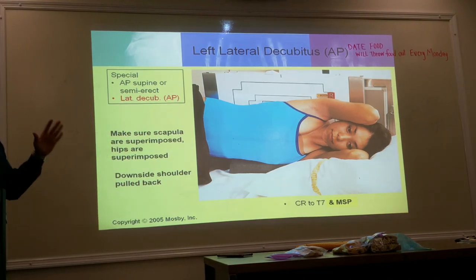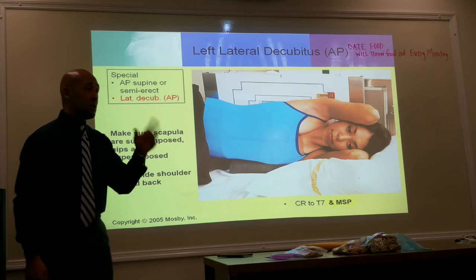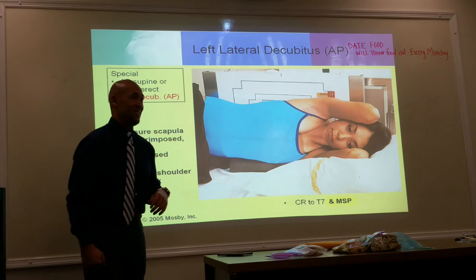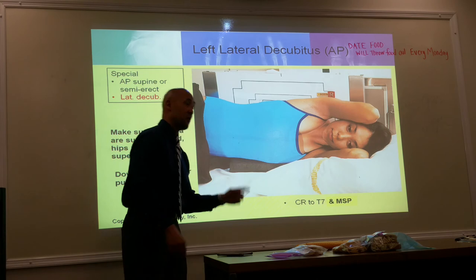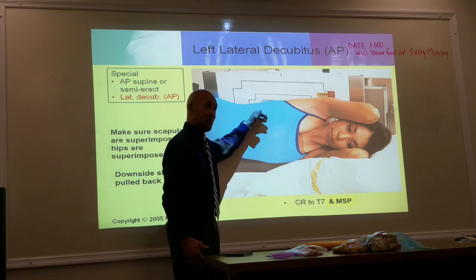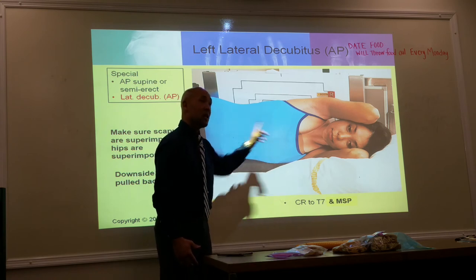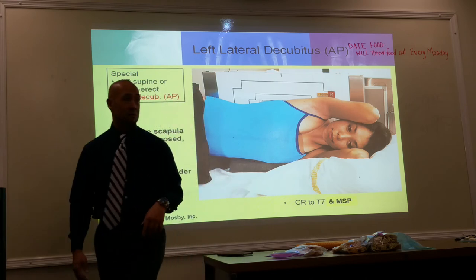But it's got to be bilateral lung, so we're going to get the picture of the whole. Right, but again, get your patient history first, because are we looking for fluid levels or are we looking for pneumothorax? Once you determine that, that will dictate which decube you're going to do. Is it the left side or the right side? Yes, you're looking at both lungs for evaluation, but is it more specific for pneumothorax, where I want to look at the side up, or more specific for fluids, where I'm looking at the side down? That will dictate what side they're laying on. But you're correct in that you have to include both lungs on there.